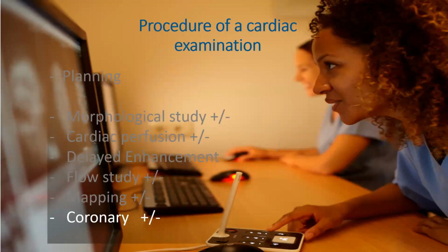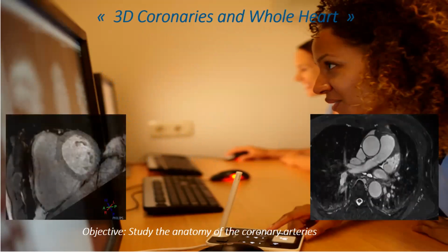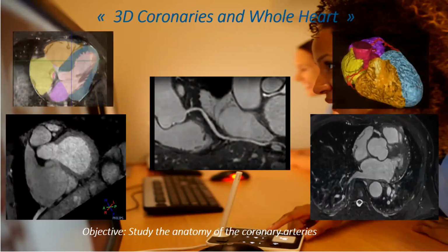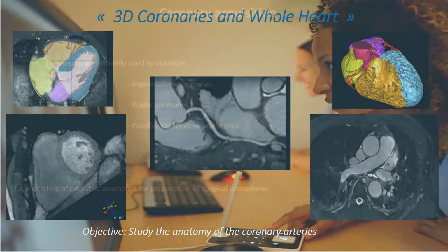For the coronary, the objective is to study the anatomy of the coronary artery. We can use some 3D coronary and whole-heart sequences.